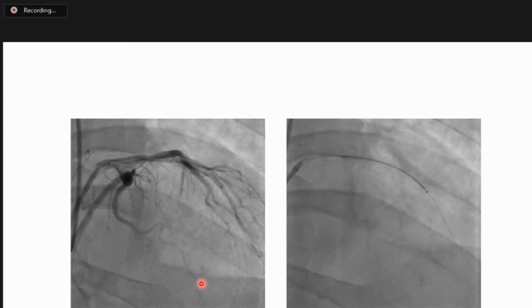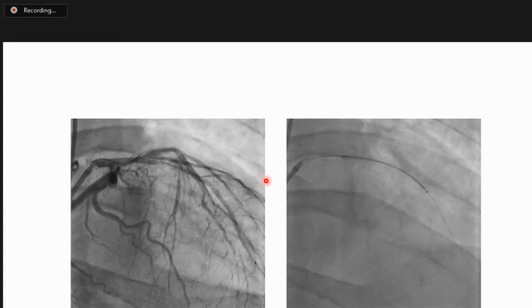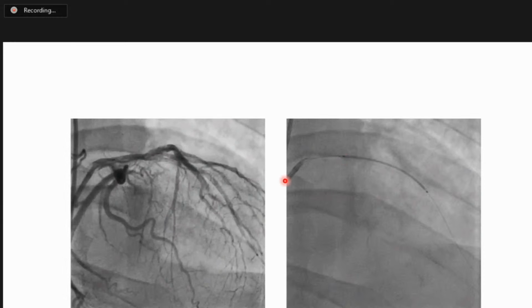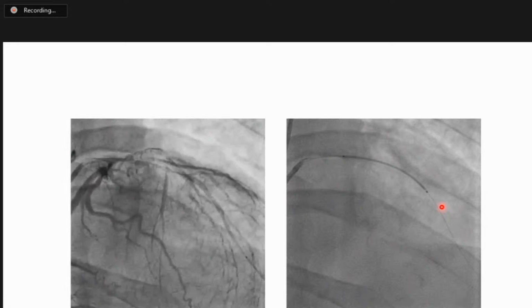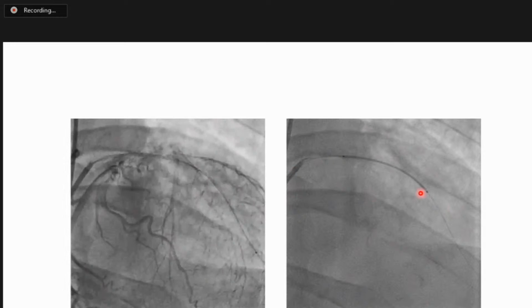And now what I have done is, I have placed a 38 millimeter stent here. If in our lab we have angio registration, that is well and good. You can place your stent extremely well. If you don't have angio registration, where do you place the stent? How do you localize this?